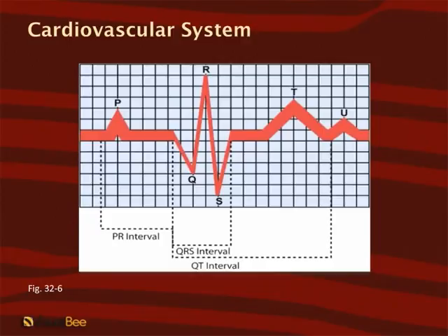On the next slide, we will be discussing the EKG paper so that you will be able to see the expected or reference range of each of the ECG waveforms of the complete complex. This is the way we'll be able to figure out whether or not the conduction of the impulse was within the normal limits.